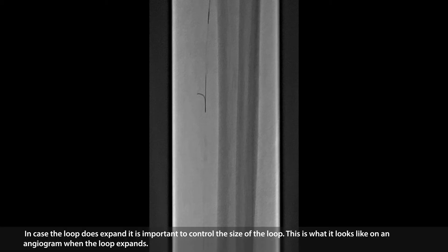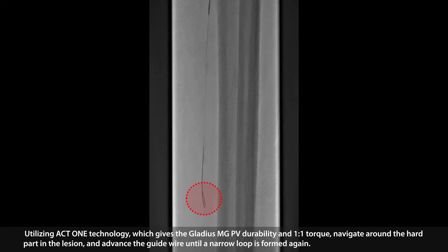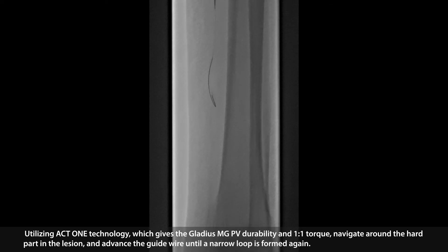In case the loop does expand, it is important to control the size of the loop. This is what it looks like on an angiogram when the loop expands. In order to control the size of the loop, retract the guide wire until it is straight again. Utilizing ACT1 technology, which gives the Gladius MGPV durability and one-to-one torque, navigate around the hard part in the lesion and advance the guide wire until a narrow loop is formed again. A support catheter can be advanced to provide additional backup support.